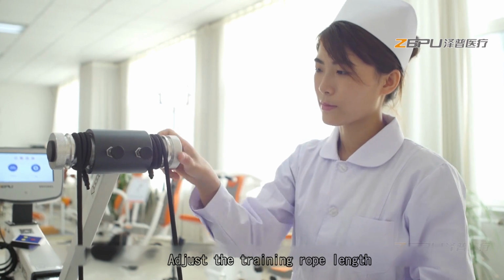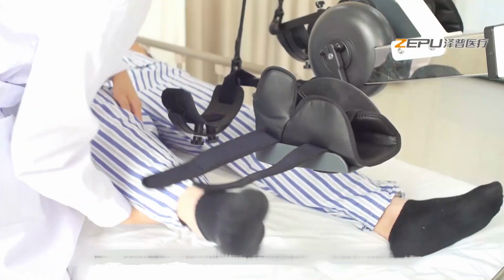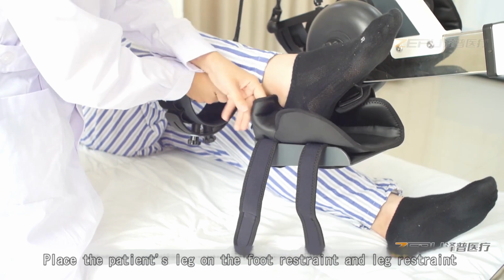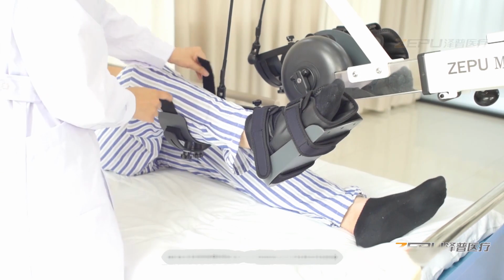Adjust the training rope length. It is advisable for the arm of the leg guard and the foot fixing device to be at an angle of about 30 degrees. Place the patient's leg on the foot restraint and leg restraint. Use straps to secure the calves and feet.